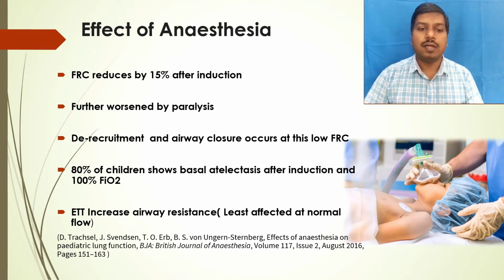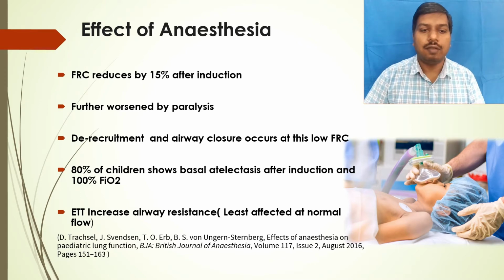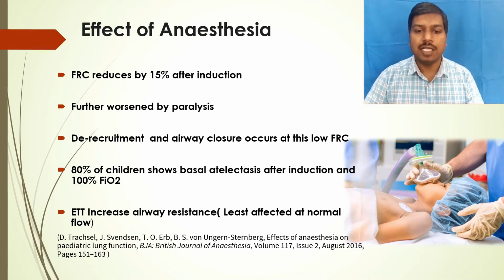And the endotracheal tube increases the airway resistance in the pediatric age group, but studies show that the difference in airway resistance produced by different endotracheal tubes is least at normal gas flows.